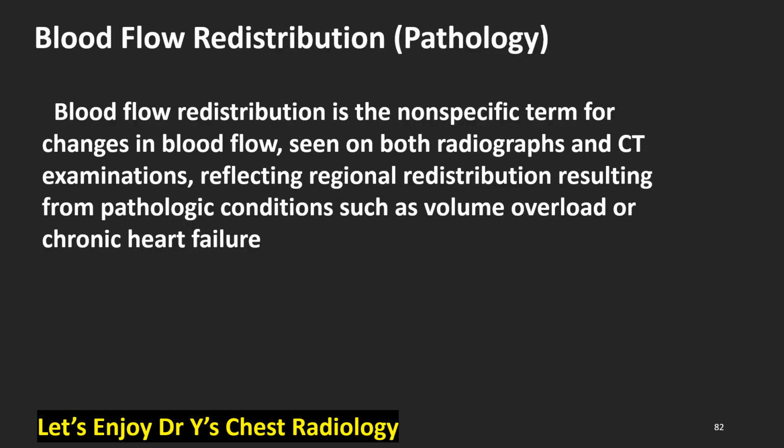Blood flow redistribution pathology. Blood flow redistribution is the non-specific term for changes in blood flow seen on both radiographs and CT examinations, reflecting regional redistribution resulting from pathologic conditions such as volume overload or chronic heart failure.